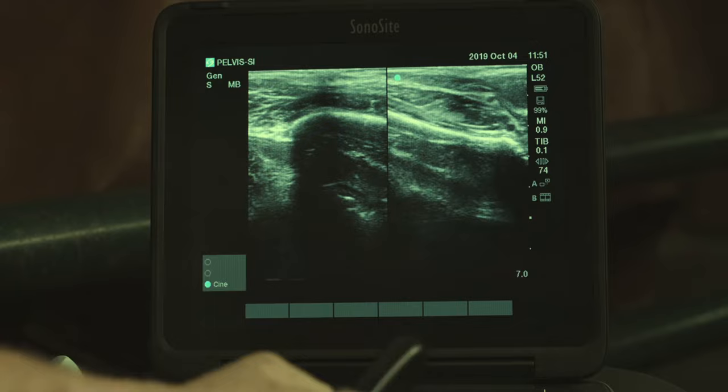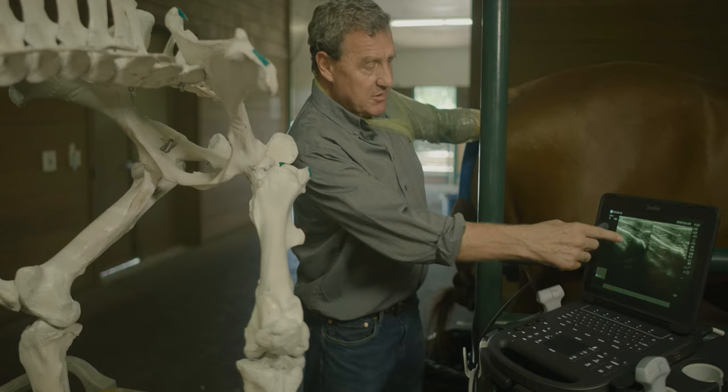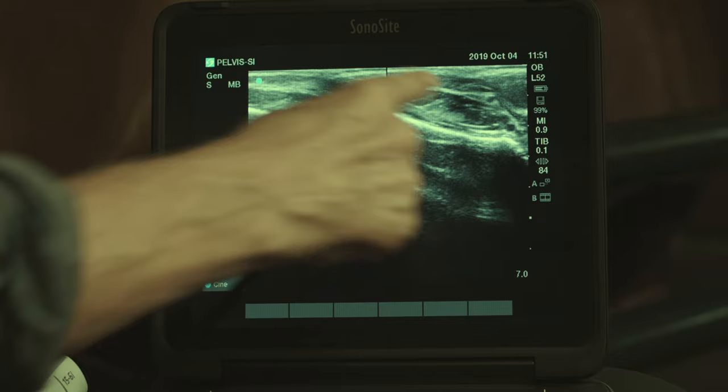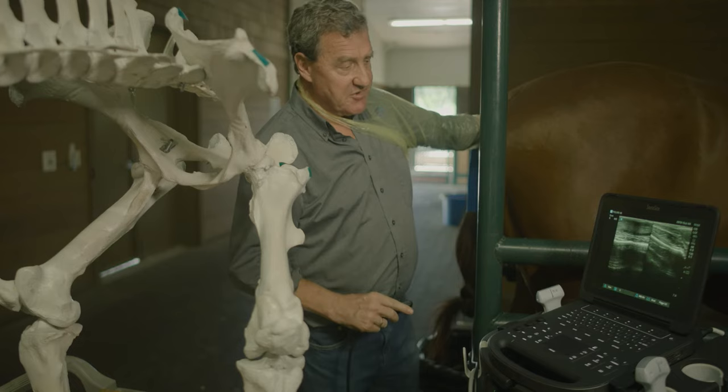We'll freeze that and flip over to the other side. You can see the opposite side, and this horse actually has what looks like a little bit of an alteration in shape of the ischial table. He may have had some past trauma — this same patient had asymmetry to the ischium tuberosity, which may explain the slightly different shape. On the specimen, looking at the cranial edge and sliding back to the caudal edge, doing that on both sides.